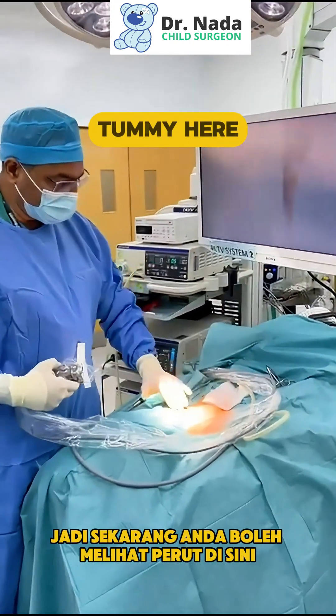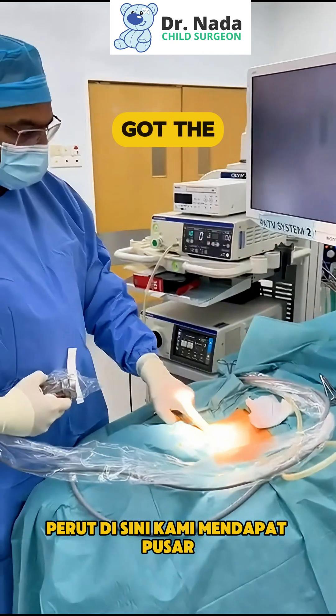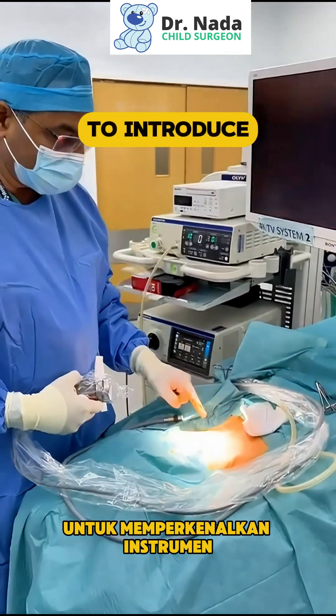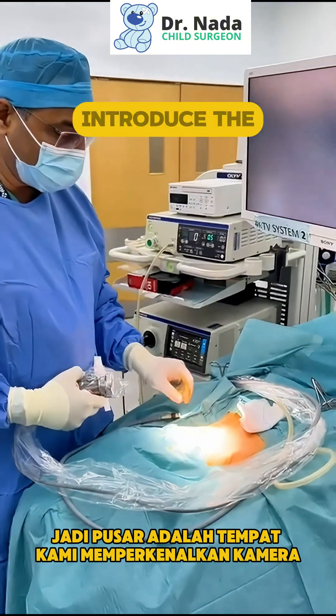So now you can see the tummy here — we've got the belly button. And then we put two other small incisions to introduce the instruments. The belly button is where we introduce the camera.